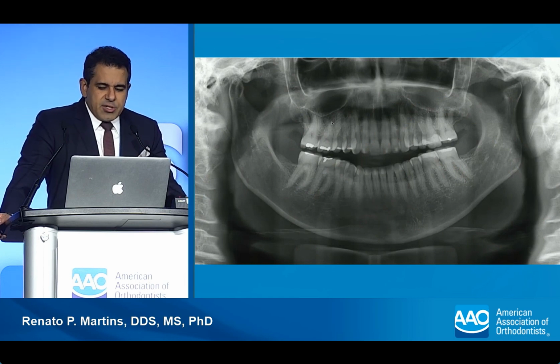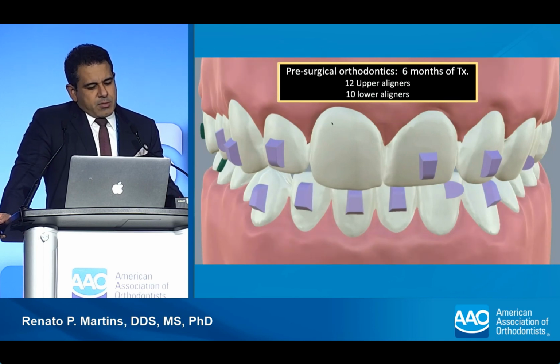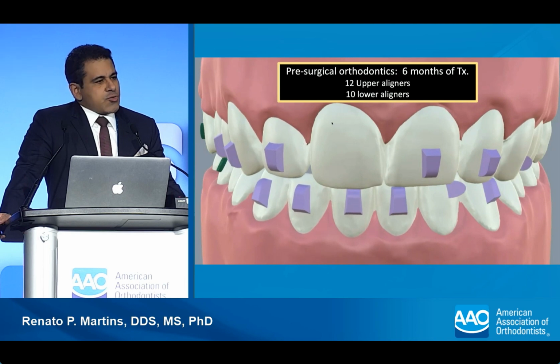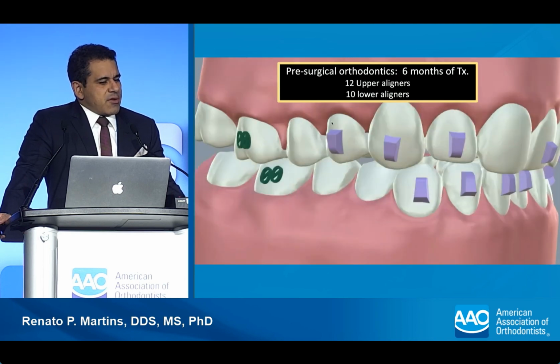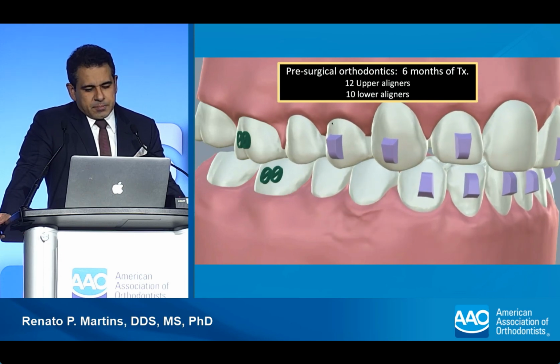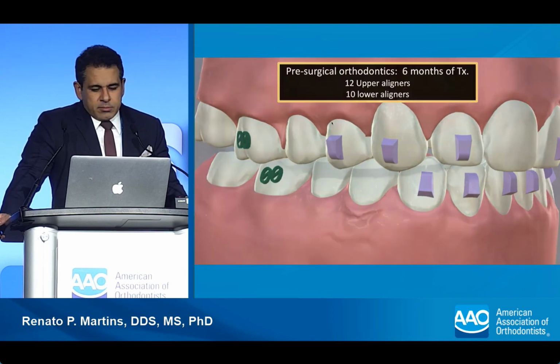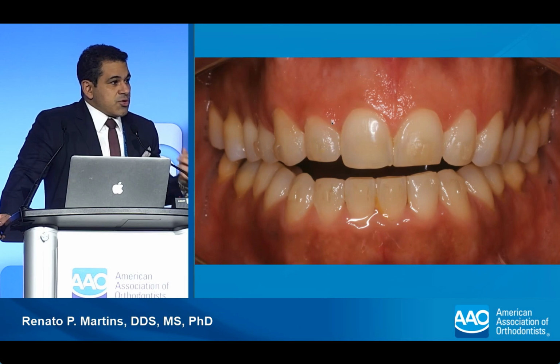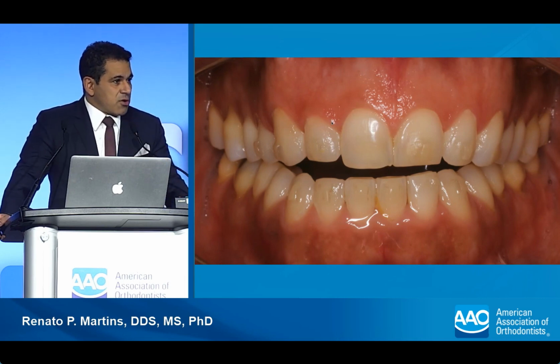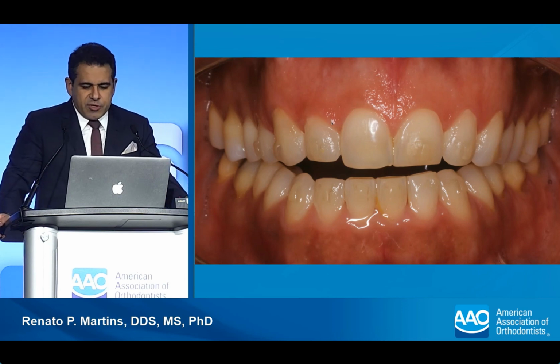and I'm going to call your attention to this little setup video. Observe the upper right lateral. It's going to extrude by itself. There's pure extrusion on that lateral. And we're going to talk about this lateral in a little bit. So she went on with 12 pairs of aligners, roughly. She used them very well. She was living in Portugal, and I was treating her away in Brazil. So I saw her 1 or 2 times only after we finished, before and after we finished this first set of aligners.